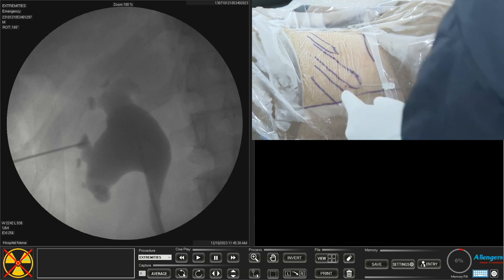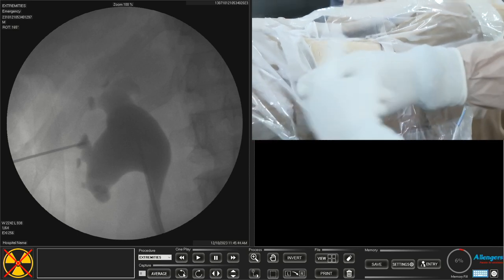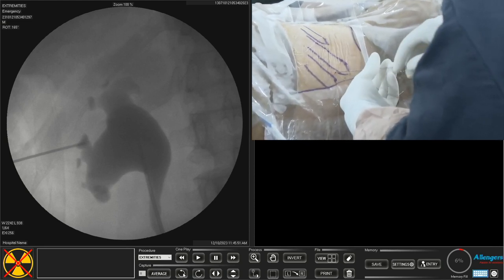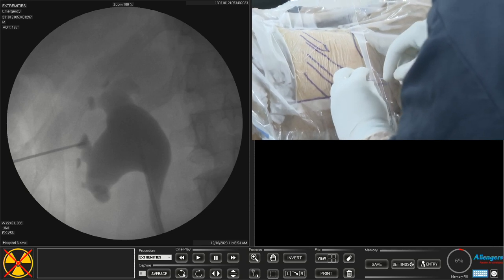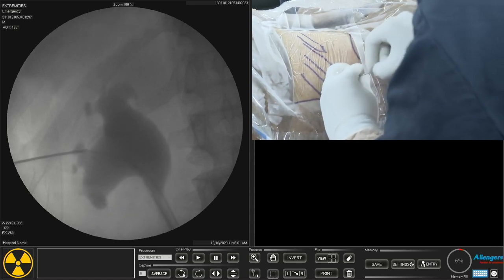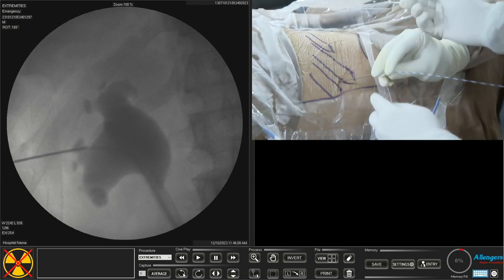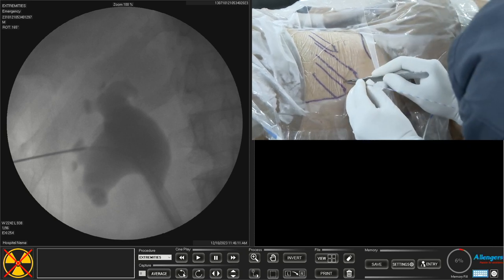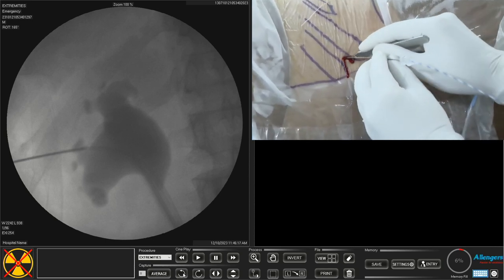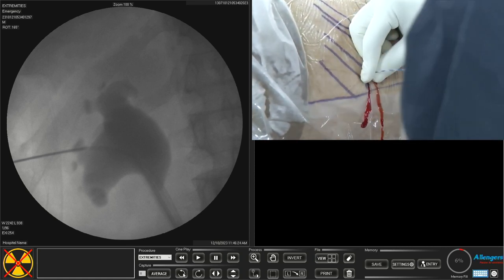I always inject a few cc of contrast after obtaining clear urine to confirm the needle is in the collecting system. Injecting contrast confirms needle position. I prefer to use a zebra guidewire with a floppy tip of 0.035 inch. When I pass this guidewire, I watch for it to pass down into the ureter — that's excellent. Once the guidewire is down in the ureter, I can avoid further X-ray exposure.